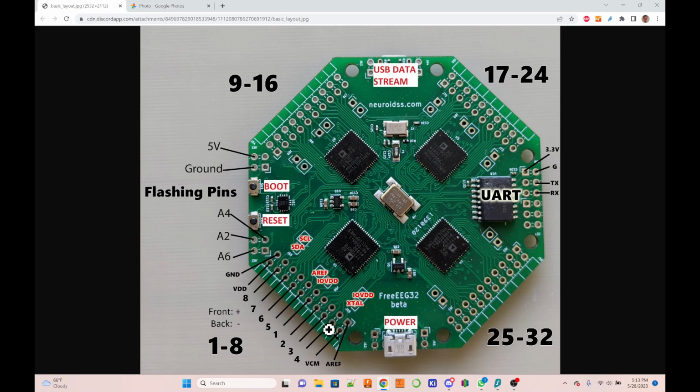So I just want to clarify what we had discussed earlier with the locations of the positive and the negative terminals. That remains the same as I had explained it, but the difference is on Cyton it is opposite. Like this here is the positive terminal of channel 1, and this is the negative terminal of channel 1. And in Cyton that is different, but as we had discussed earlier, that is still how it is.